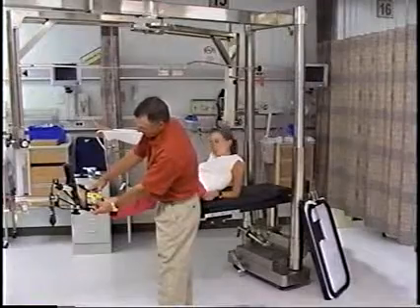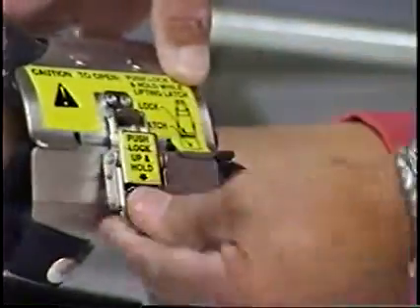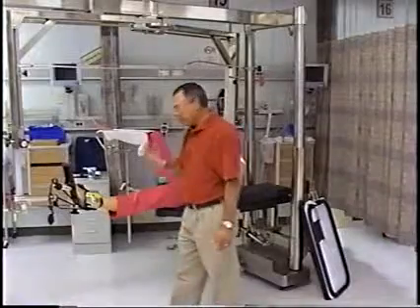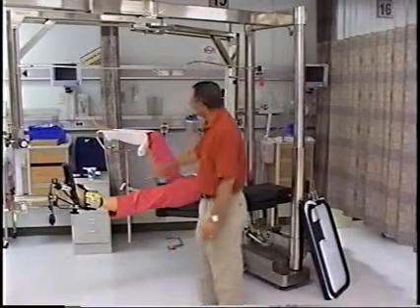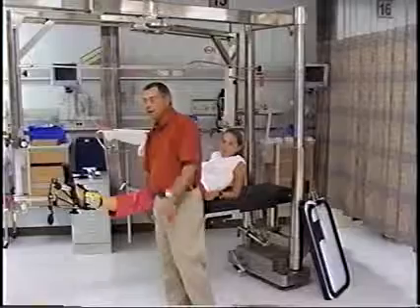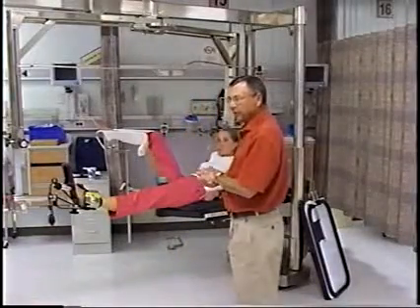There's a little flange that says push up and hold, and then it comes open. Okay? If you can set this table up, you need four things. You need a traction cuff, you need a perineal post, you need a place for the well leg, and you need a place to support the legs before you put them up in traction. Four pieces, and you can set this table up for a fracture, for a left hip.